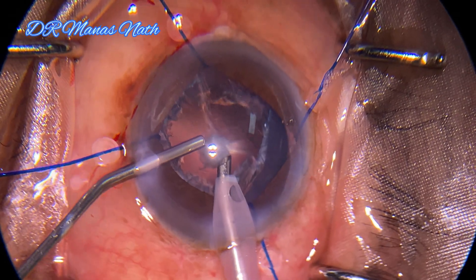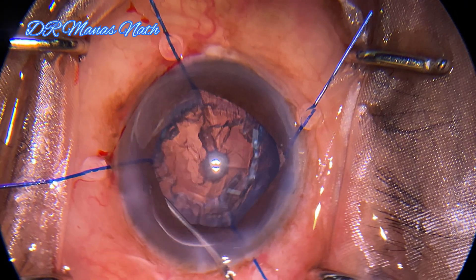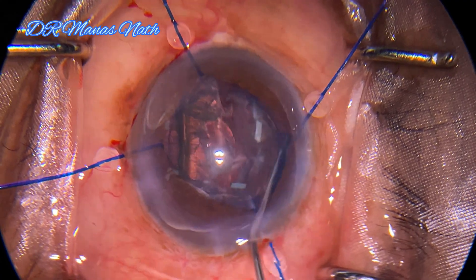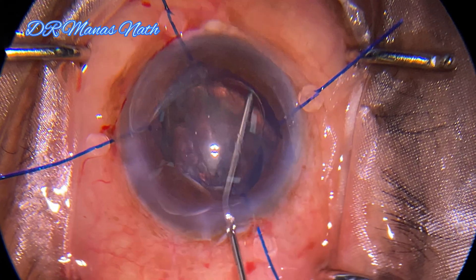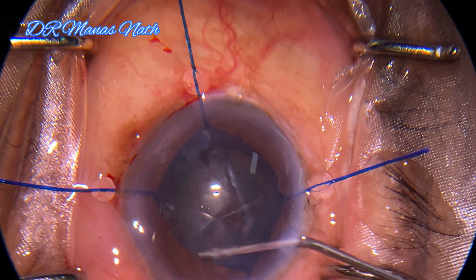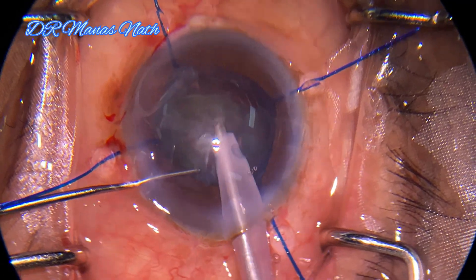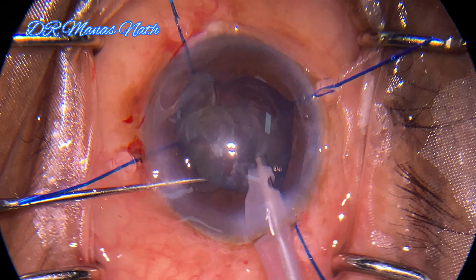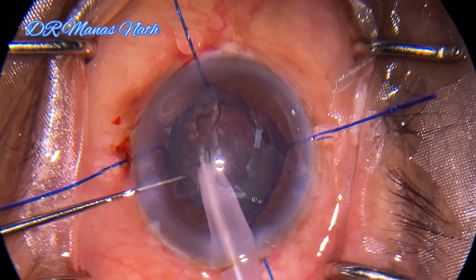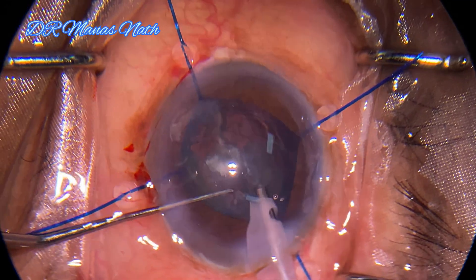Never allow the chamber to collapse. Now doing visco-dissection so as to prolapse the epinucleus out of the capsular bag — it will also help as a protective cushion. Now removing the epinucleus with lower parameters. One should be quite gentle and slow in such cases; although it takes time, one should not lose patience.